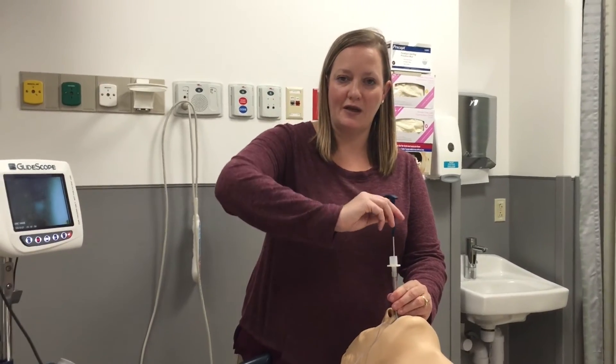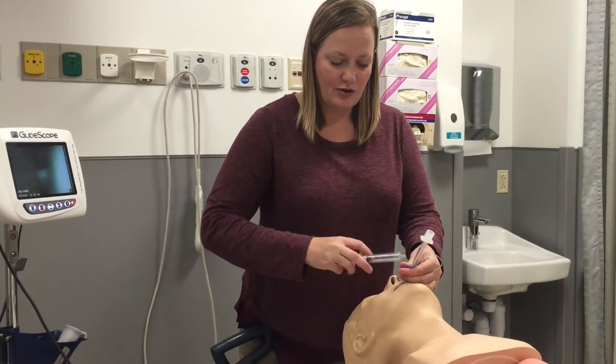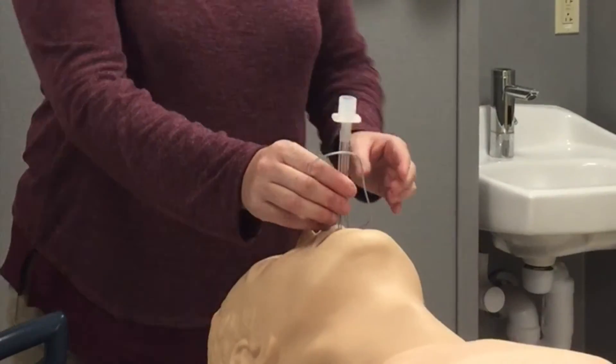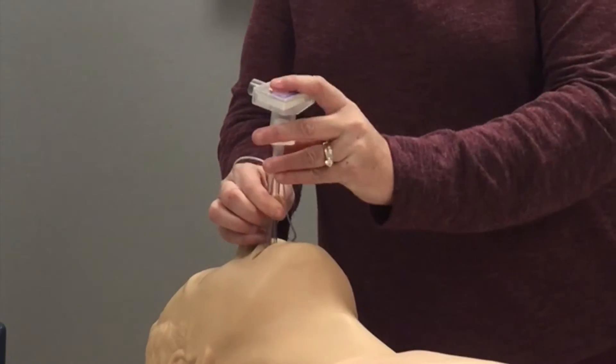You will remove the stylet away from you and away from the patient. You will inflate your cuff and then, without letting go of your ET tube, you will place the CO2 detector on the tube.